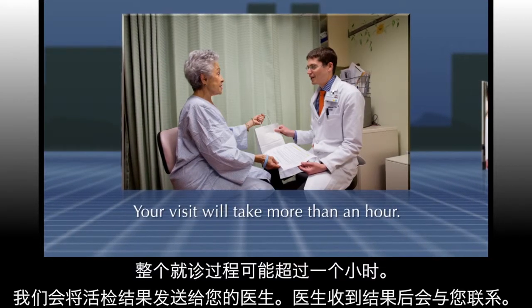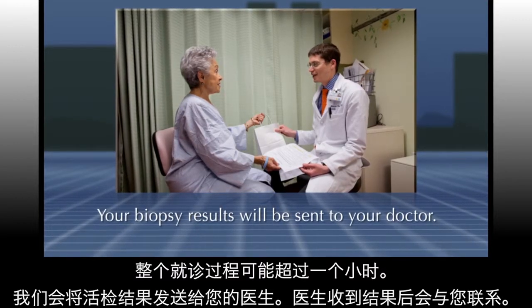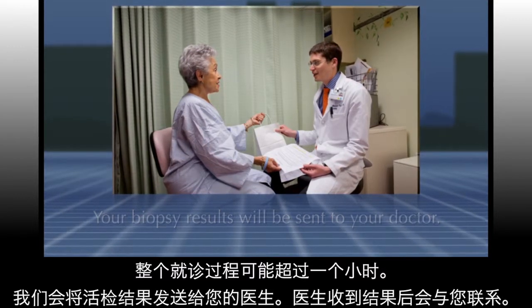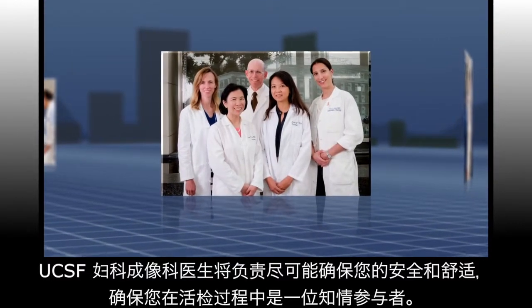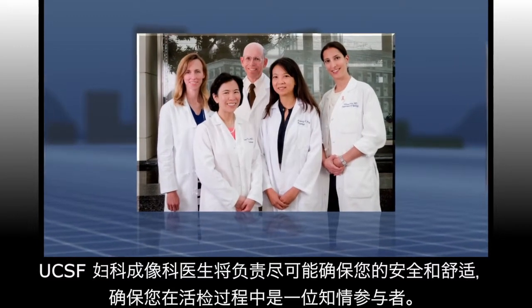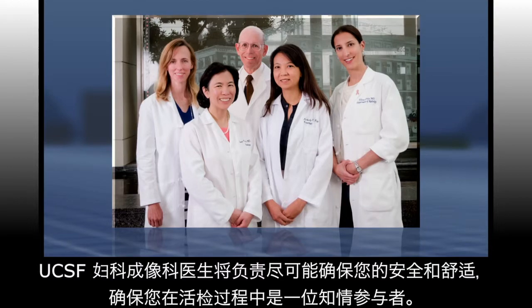Your full visit will likely take more than an hour, and your biopsy results will be sent to your doctor, who will contact you. The doctors at UCSF Women's Imaging are committed to doing everything possible to ensure that you are safe and comfortable, and that you're an informed participant during your biopsy.